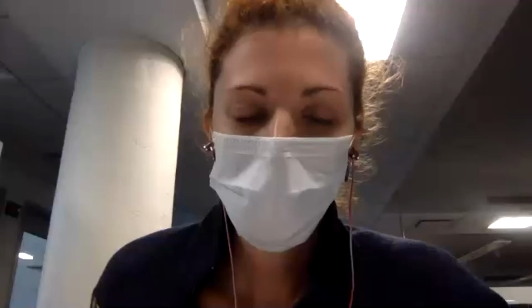But actually, it's a good point. We haven't tried yet to normalize the epileptic activity that we capture in the awake session, because most of it is in sleep. But it's really interesting to see what the result will look like. We also want to compare, as you mentioned, EEG and MEG. We implemented a flag that you can insert into our pipeline if you want to use only MEG, only EEG, or both. In other studies we compared the three combinations, and we also want to do it here with the Granger causality, to see what happens if we run it using only the EEG data, and how well we capture the connectivity. So yeah, this is one of the next steps.